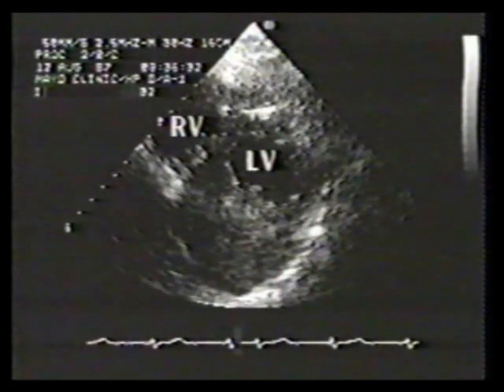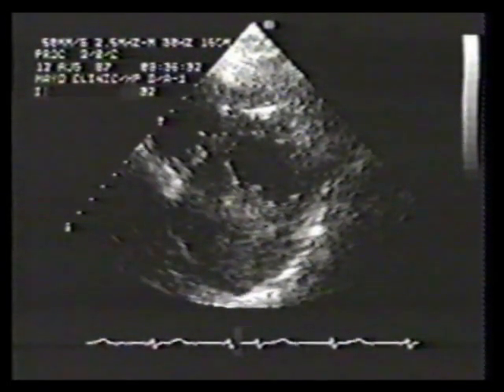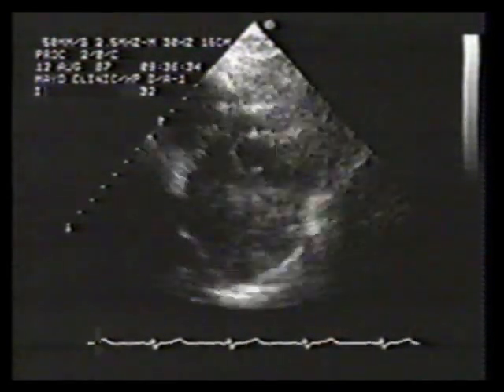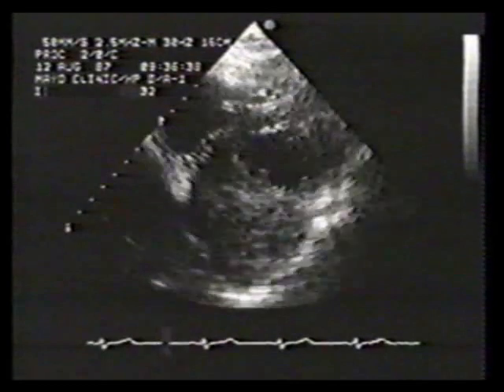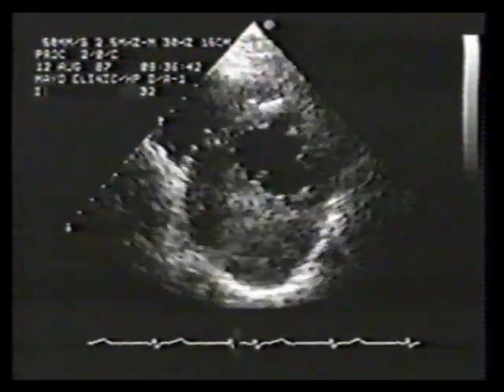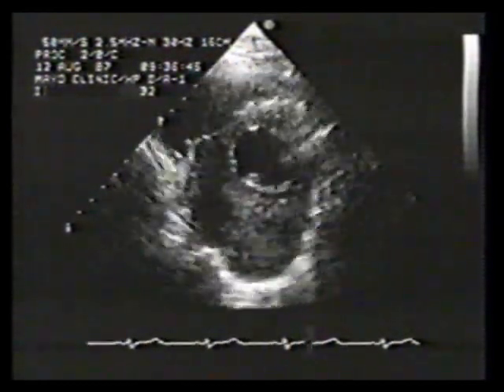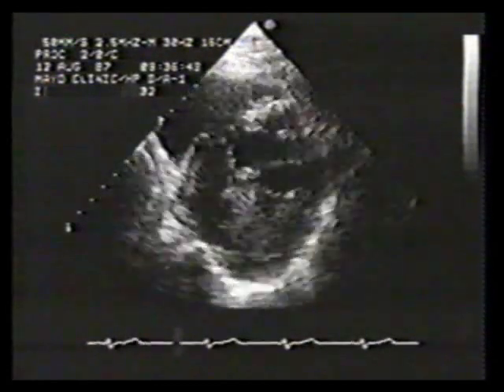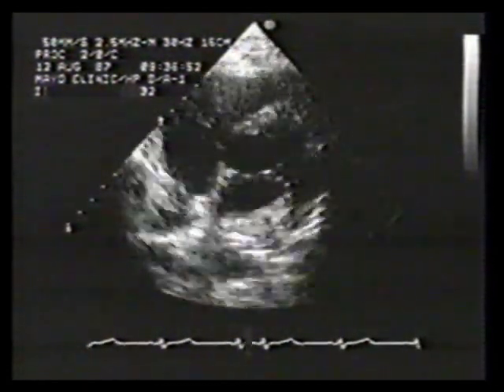On short-axis scan at the level of left ventricle, the tumor is clearly visible behind the left ventricular posterior wall. More importantly, the tumor mass appears to be incorporated into the myocardium and actually in the ventricular septum replaced the myocardium and is typical of a metastatic tumor. With scans toward the base of the heart and apex, this distinction of malignant versus benign nature becomes more evident.